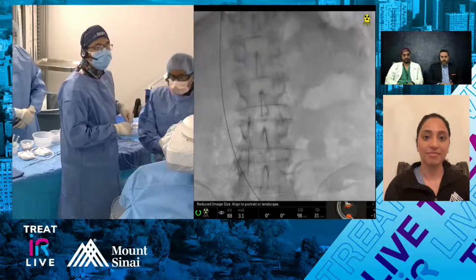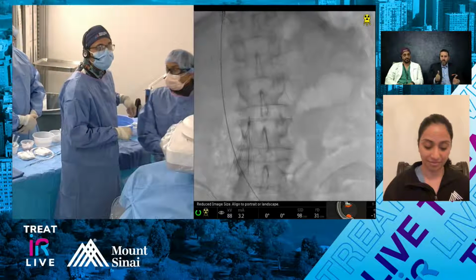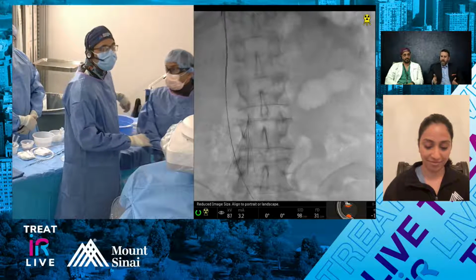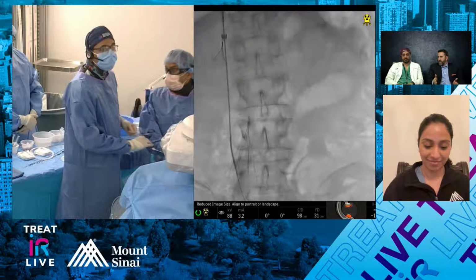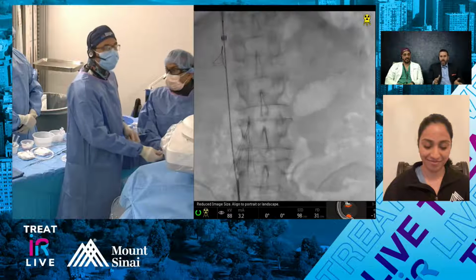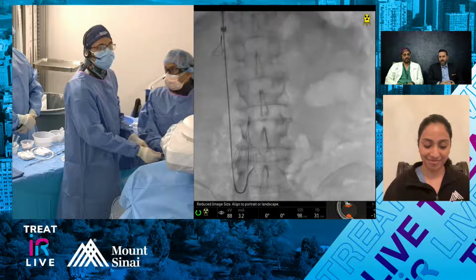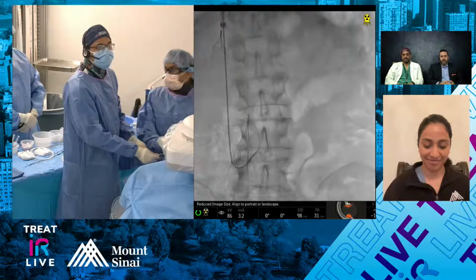I know at meetings, especially a couple of years ago, a lot of folks were saying they enjoy not having the GA because they get a little bit of feedback. So if somebody reacts, I don't really find that helpful. Some experienced operators were saying that if the patient is reacting more than I would expect, then maybe I'm doing something I shouldn't be. I don't personally find that helpful, but I haven't run into that yet.